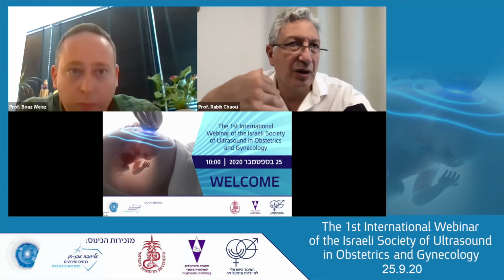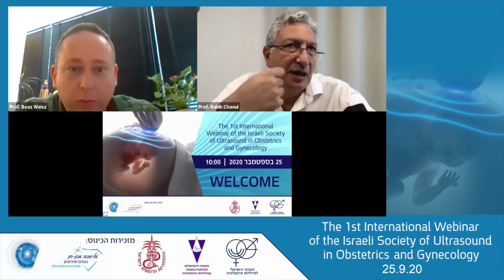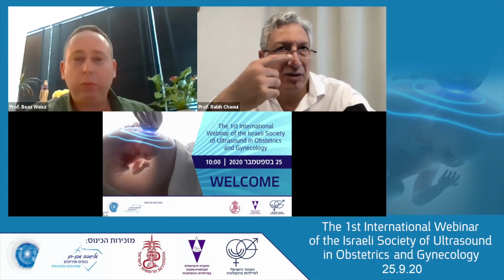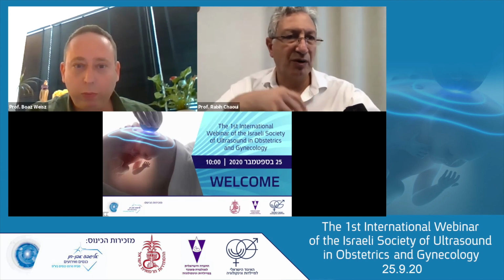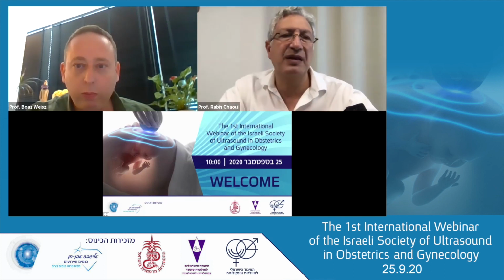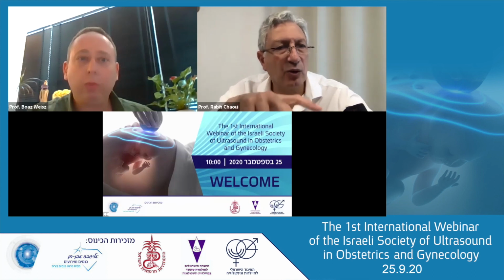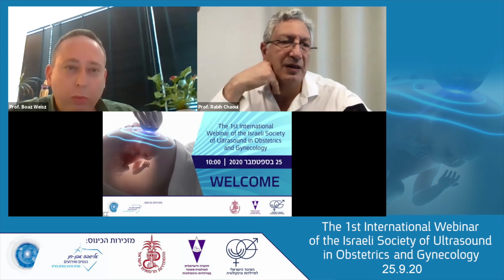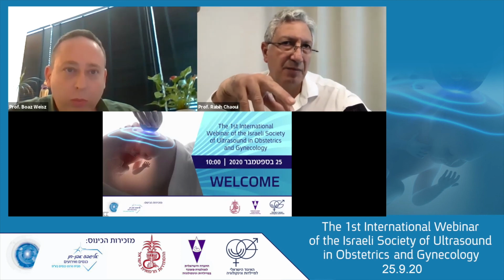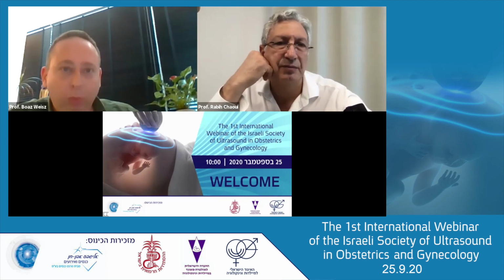So in tetralogy I control rather the blood flow direction, not the connection. You may not see it straightforwardly on the five-chamber view, but you see a V entering from the side. This is where I'm careful and look at the aortic view. I also had a few cases like this with normal LVOT, and then I asked the cardiologist to check for coarctation after birth. Thank you.